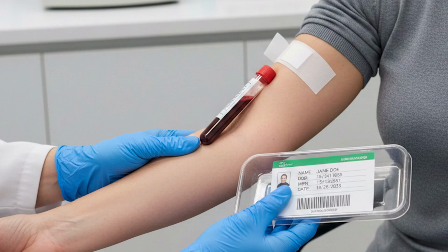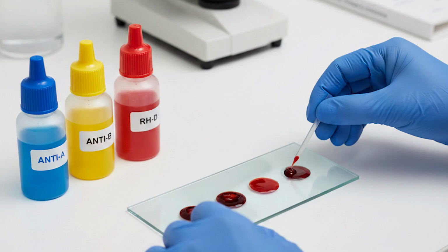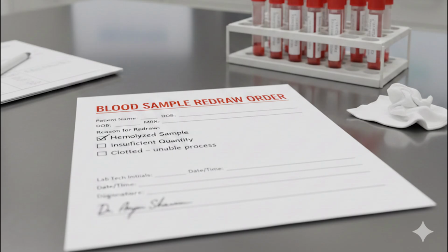Evidence of sample mismatch. Many times, mismatched samples are detected with the previous results. Patients having abnormal results with previous normal reports, or normal results with abnormal previous results, are carefully investigated for sample mismatch. A blood grouping may sometimes be the evidence of mismatch. Do not report the results, order a redraw, and alert the other sections to avoid giving wrong reports.